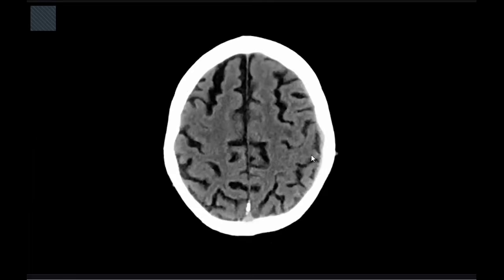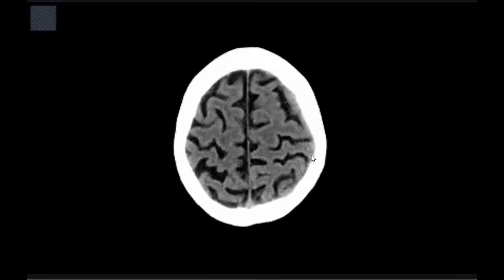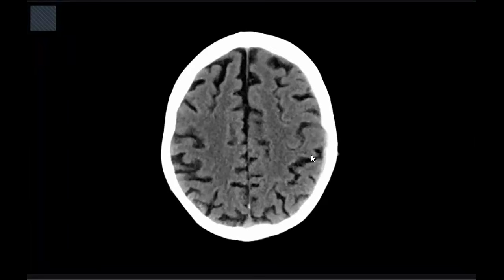No hyperdense signal in the subarachnoid space or subdural spaces. Doctor, please, I will give you one advice. Don't say "no" except if you are sure there is no abnormality. Let this be at the last of your list.